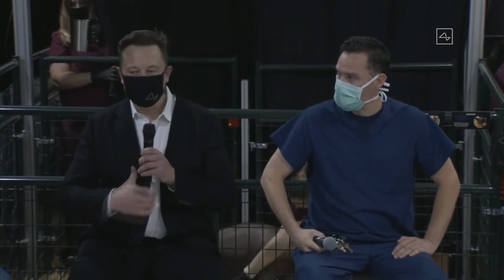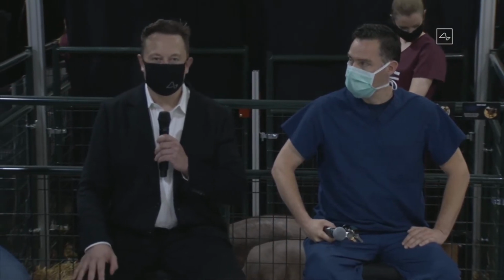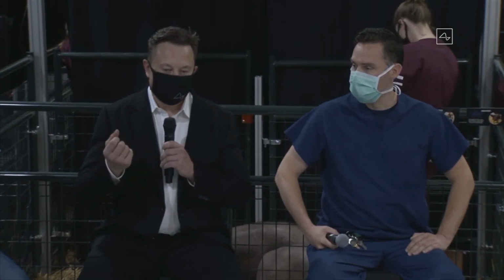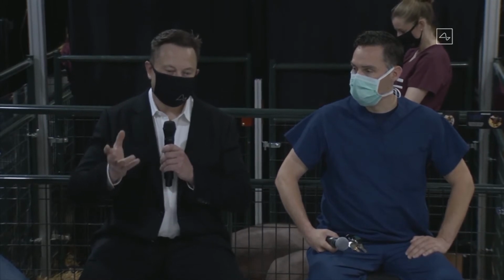So our first clinical trial is aimed at people with paraplegia or tetraplegia, so cervical spinal cord injury. We plan to enroll a small number of patients to make sure the device is safe and that it works in that case. Yeah, so just to elaborate on that, if somebody has a severe spinal cord injury, to the degree that they have very limited control even over their facial muscles, with this implant you can, just by thinking, output words, and you can type, and you can control a computer, control a phone, which is pretty wild.